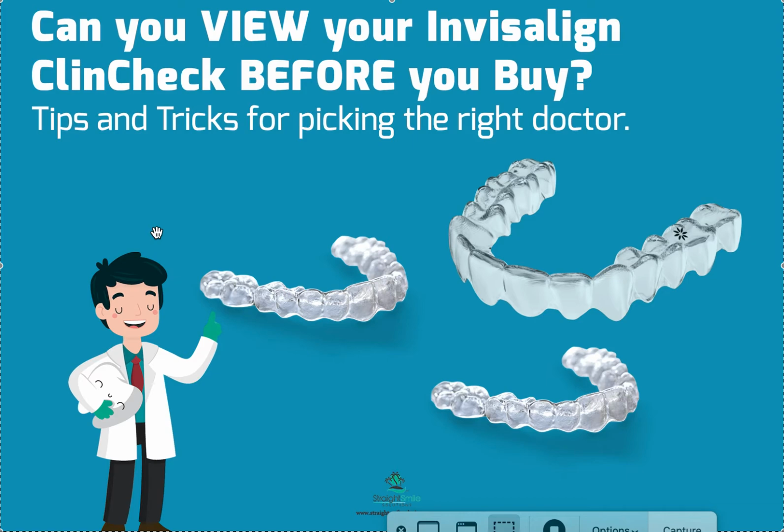So if your doctor does not have an intraoral scanner, and you are taking a gooey, rubbery impression for your aligner treatment, that's a sign your doctor is not experienced. That's okay, as long as you're aware of that. But I think most doctors are less likely to let you see your ClinCheck without putting down some deposit if they're doing impressions, because it costs them money. It's resources. The scanner doesn't cost you anything. Maybe the cost of the tip, which is like $3, but it's pretty much a drop in the bucket, especially if you're a good patient.